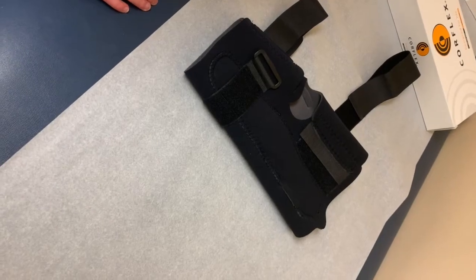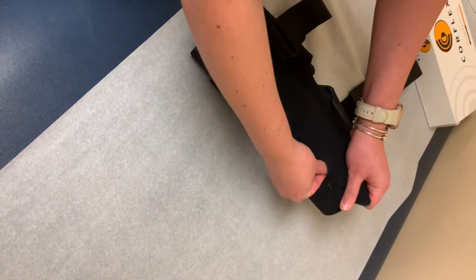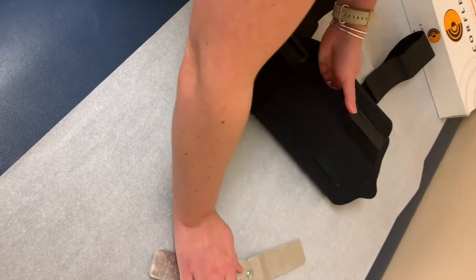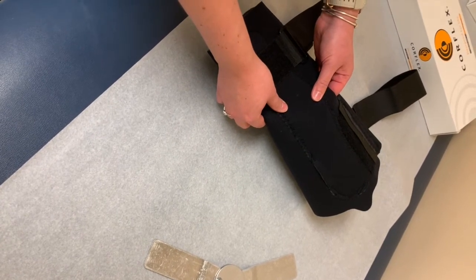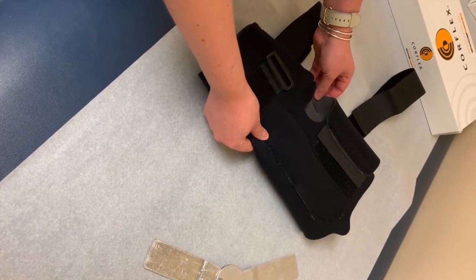To clean and care for your brace, you can wash it by taking out the metal hinges first, using the slits on the sides of the brace. Once you have both hinges out, you can wash the brace with a mild soap or detergent and warm water, laying the brace out to air dry afterwards.